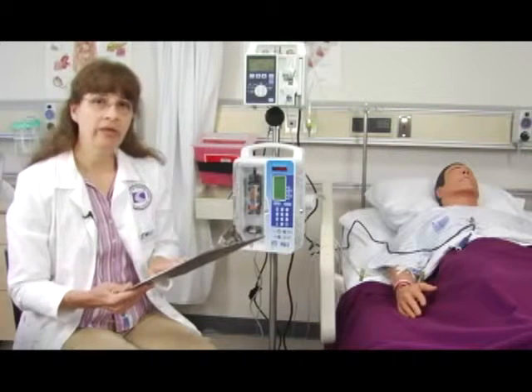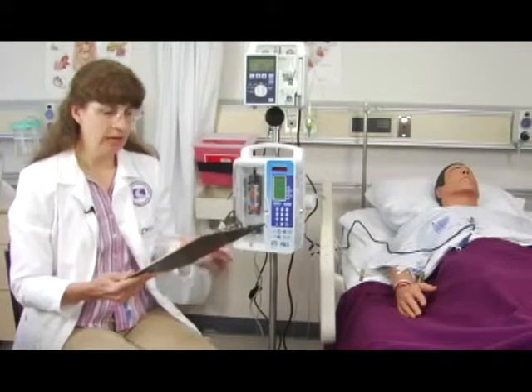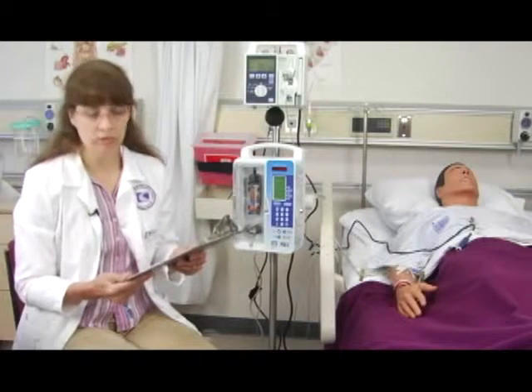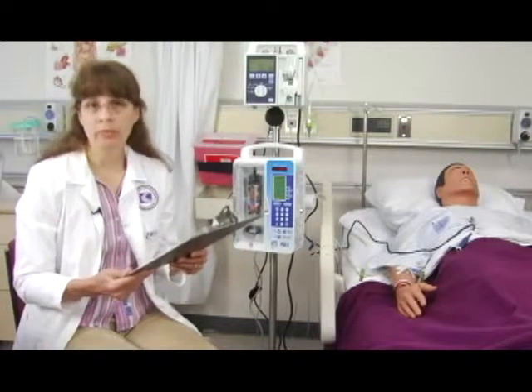You want to verify the physician's order for the changes to the prescription. Now, the change could be to the dose, to the lockout interval. The physician may have ordered a continuous rate. It may be to the mode, to the 4-hour limit.